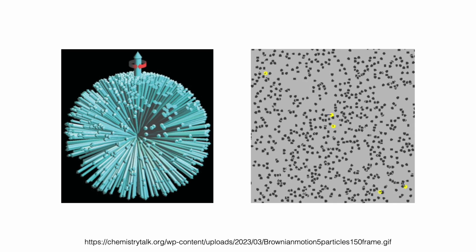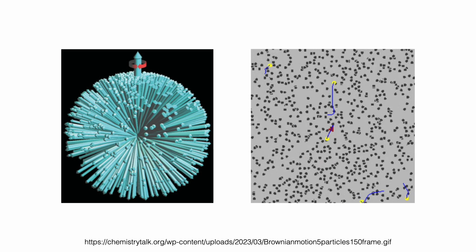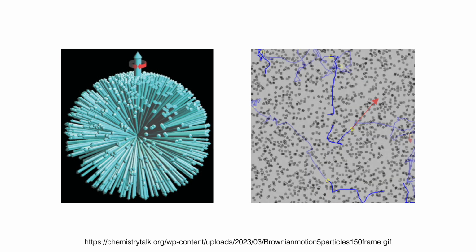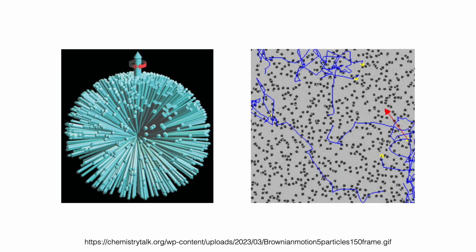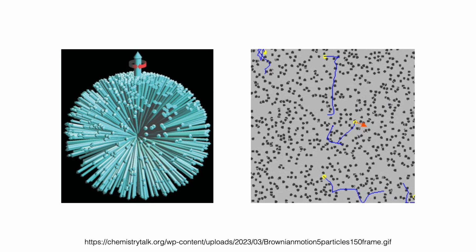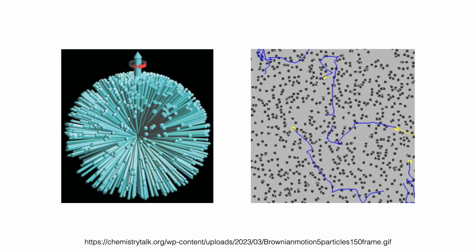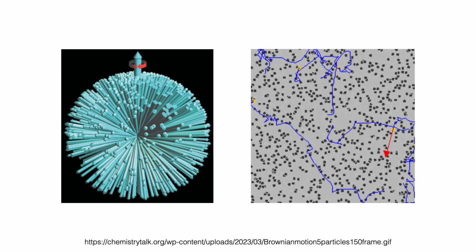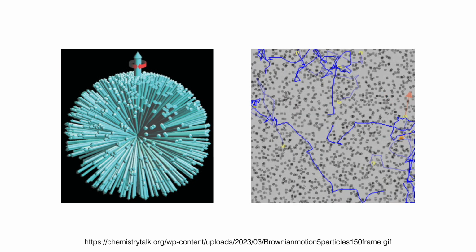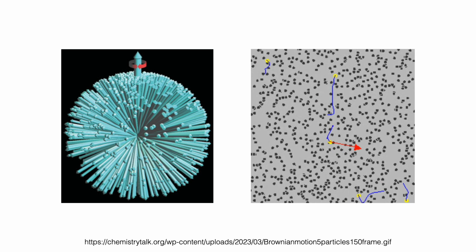Now this all assumes that the particles don't move, that they're completely stationary. However, because the temperature of the particle is non-zero, we have Brownian motion of the particles, like shown in this video on the right. And you can see the tracks of these particles, they're taking a random walk. What this means for MRI is that as we collect the data, the individual atoms that contribute to the net magnetic field are exchanging themselves between different locations, and so there's noise added to this net magnetic vector.